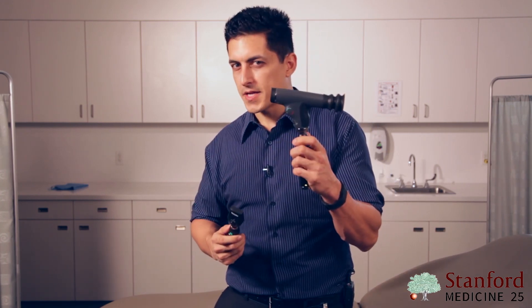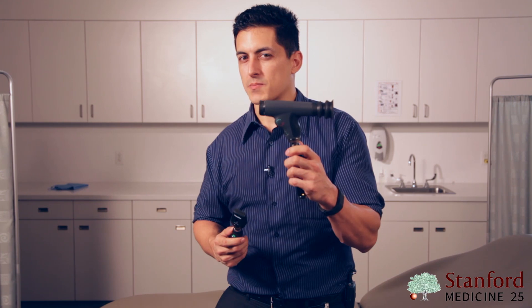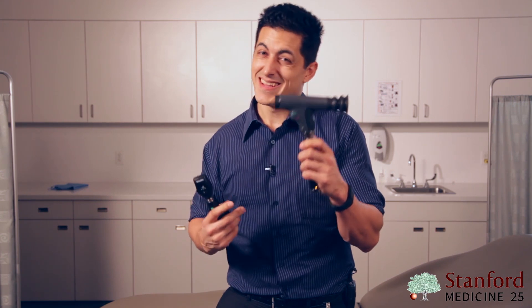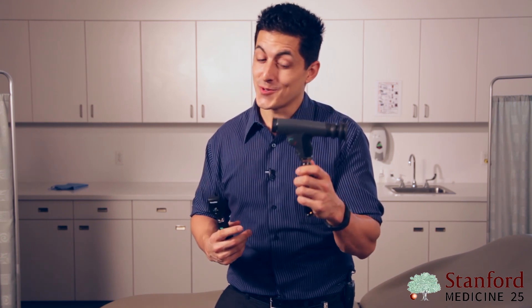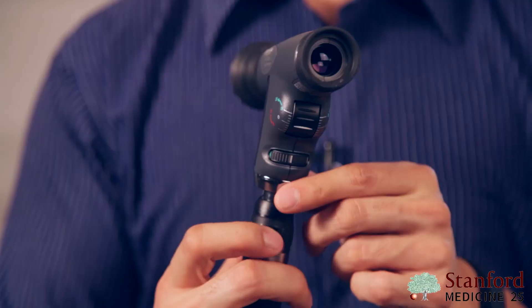For the purpose of this video, we're going to be mostly sticking with the panoptic because one, it's easier to use, and two, it has a greater field of view. I should also mention that while we'll go over the mechanics of using the panoptic, it's essentially the same thing as the traditional ophthalmoscope as well.